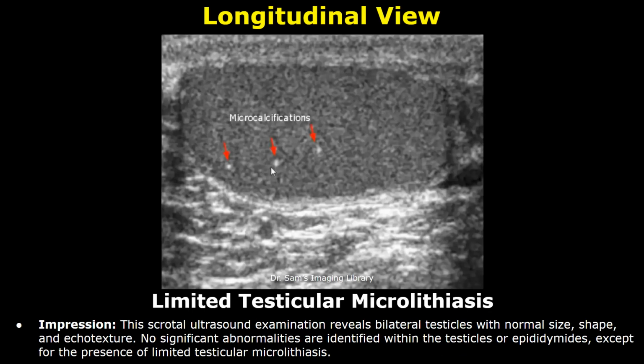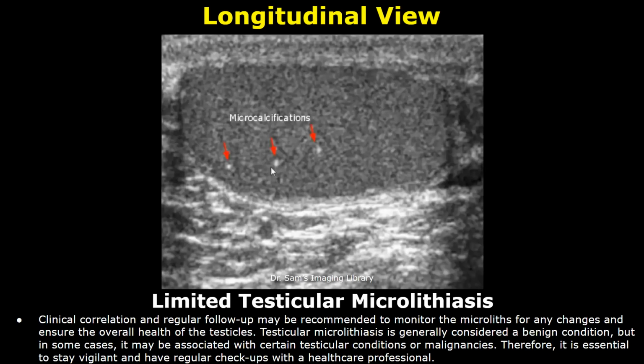So this patient had a history of limited testicular microlithiasis. You can mention the microlithiasis in the impression. No other significant abnormalities were found. Clinical correlation and regular follow-up may be recommended to monitor the microliths for any changes and ensure the overall health of the testicles.